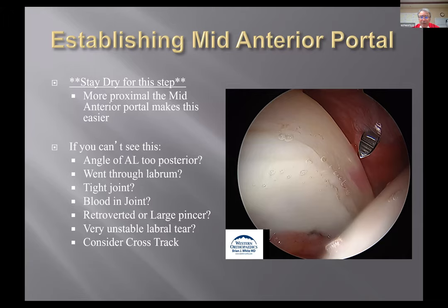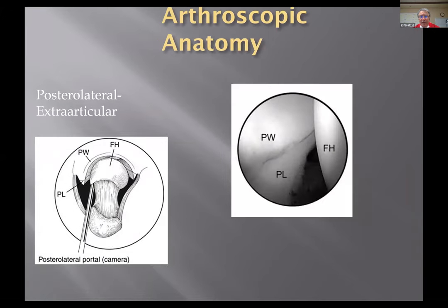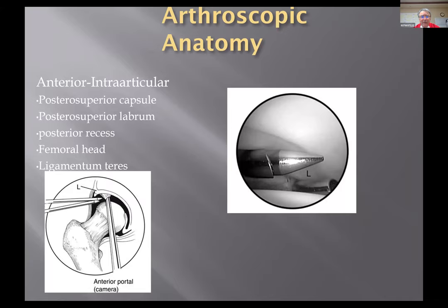So you miss that, put your guide wire in, and now you're coming in through that anterolateral portal. And then you can look at the acetabular wall, the femoral head, probe the labrum, do what you need to do. Start looking at how your seal looks. Look for what's called chondrolabral delamination. We call it a wave sign. We can see the ligamentum teres. Some of our ligamentously lax patients have ligamentum teres laxity.